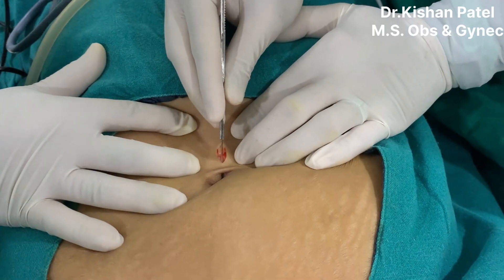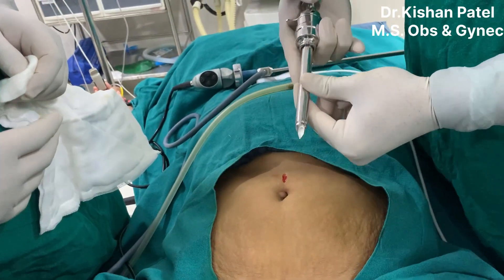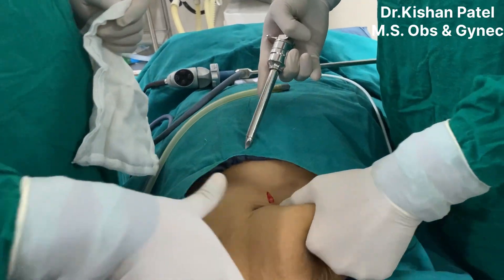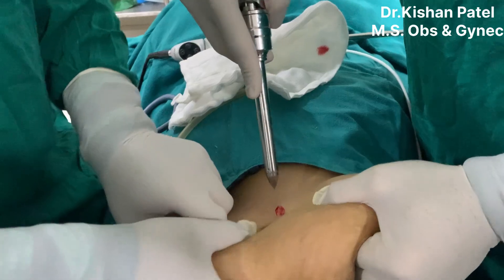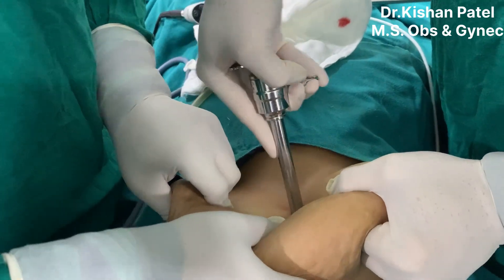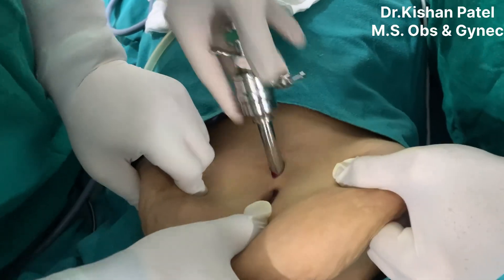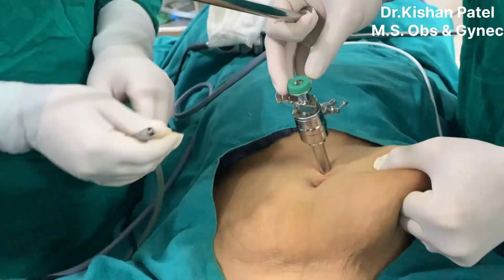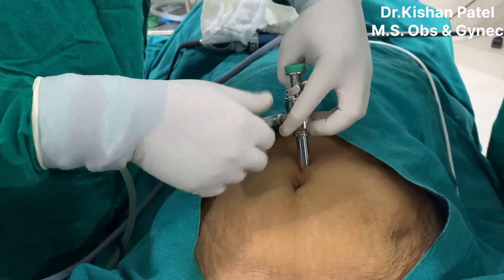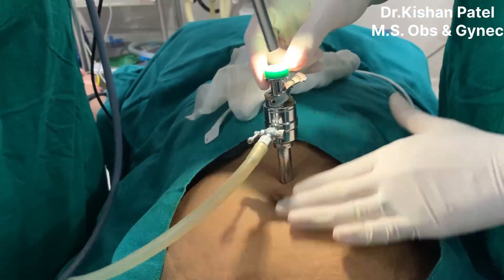We'll keep the incision over here. We are using a vertical incision, but you can also take a transverse incision. This is an 11mm supraumbilical main port. You can see I am holding my main port — the 11mm port — with a guard using my index finger. We will enter vertically, exactly at 90 degrees. You should always enter your port vertically at 90 degrees.